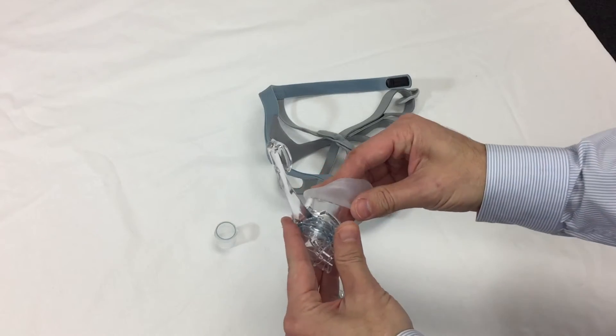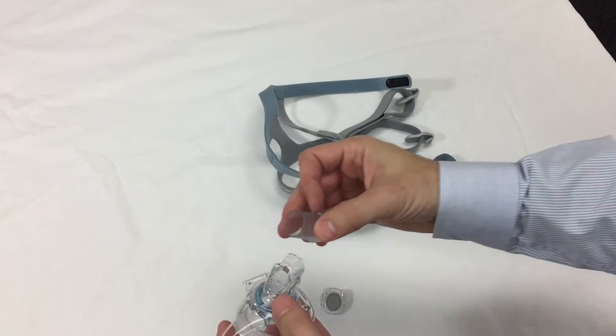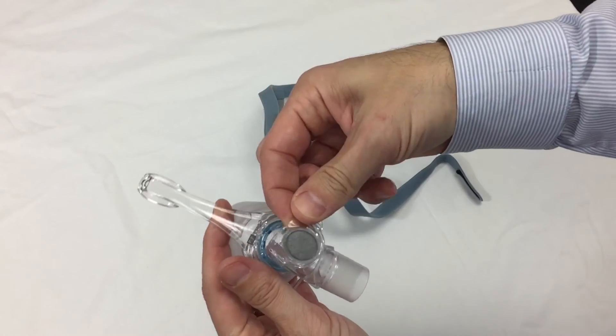So as the cushion wears down over time, you can just replace the cushion. You can see how easy that is to pop back together. There's the elbow, which swivels all the way around.